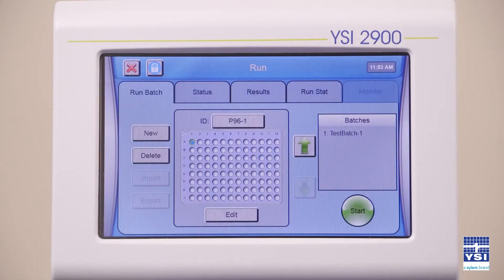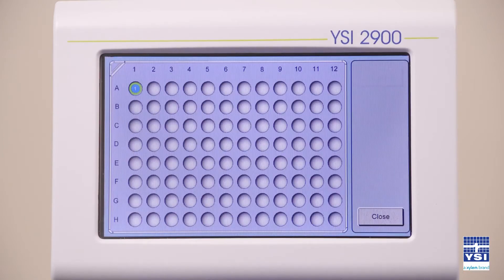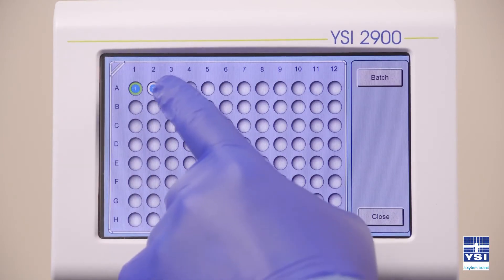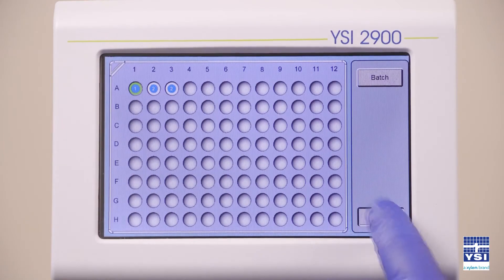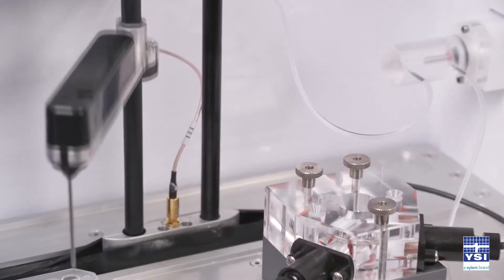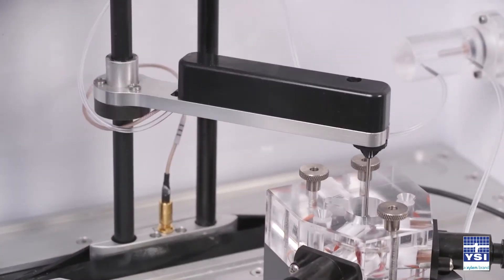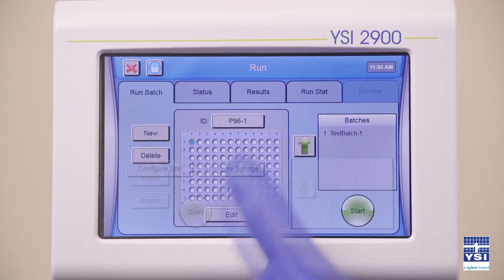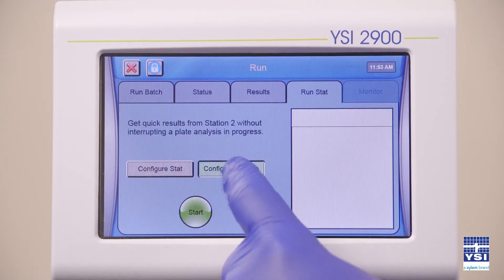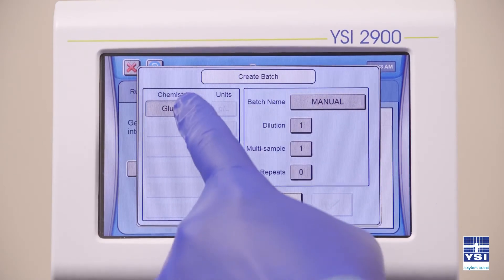The YSI 2900 Biochemistry Analyzer offers a 96-well sample tray, which accommodates samples ranging from 10 to 50 microliters, full sample automation, manual sampling with syringe configuration, programmable auto-calibration events, multiple handling options, and much more.